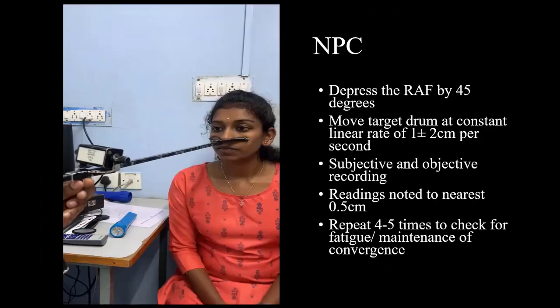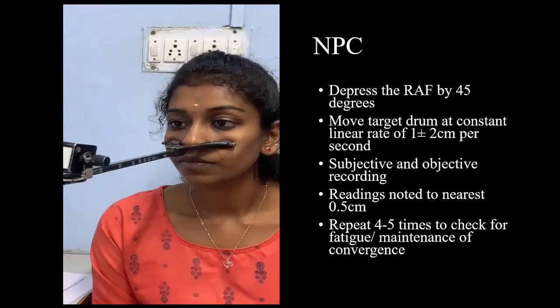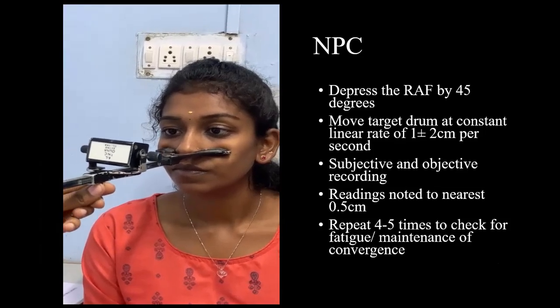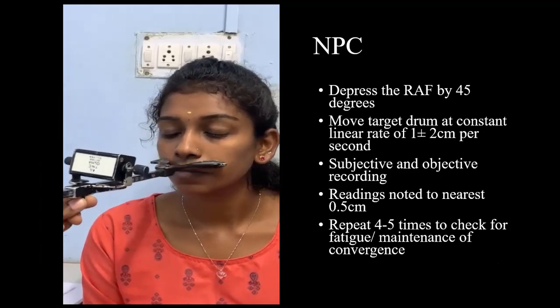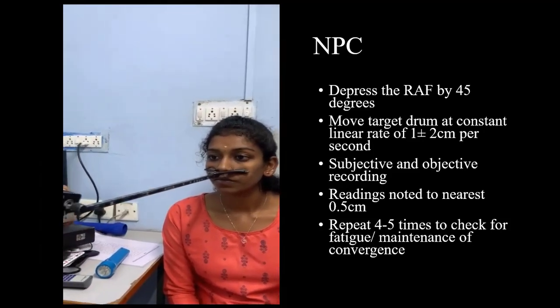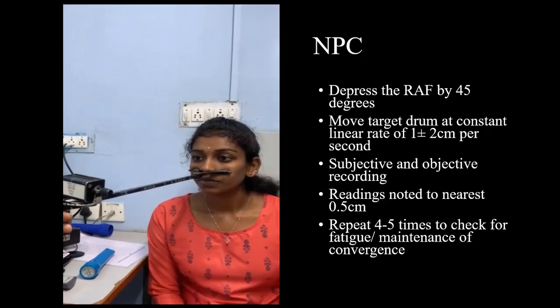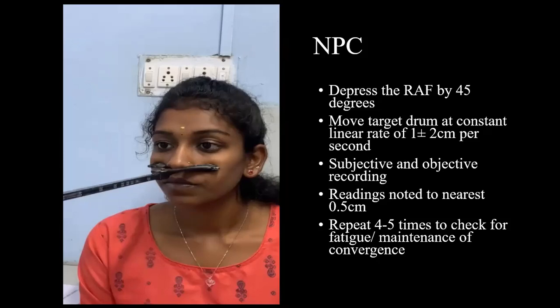To measure the NPC, we have to depress the RAF ruler by 45 degrees and move the target drum at a constant rate of 1 centimeter per second. Subjectively, we can also see that the patient is converging both the eyes, and we have to ask the patient when they are seeing double. The readings are noted to the nearest 0.5 centimeter and have to be repeated so that we can check for the fatigue or maintenance of the convergence. The Prince ruler is also there. It is 24 inches long.